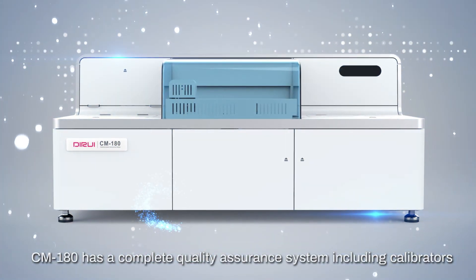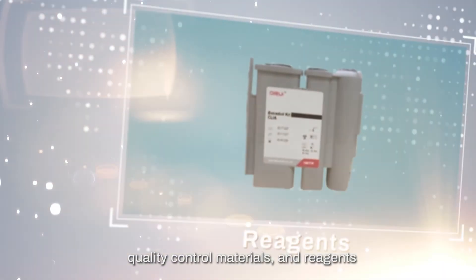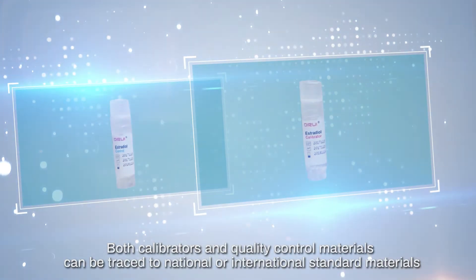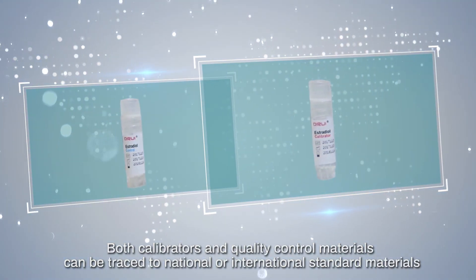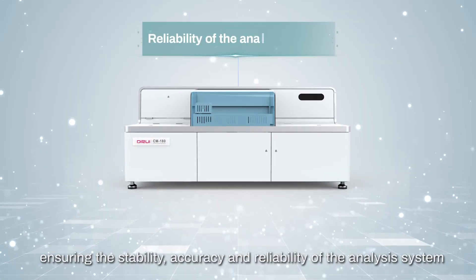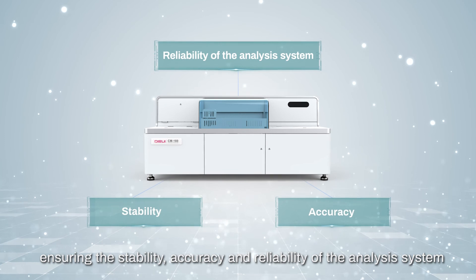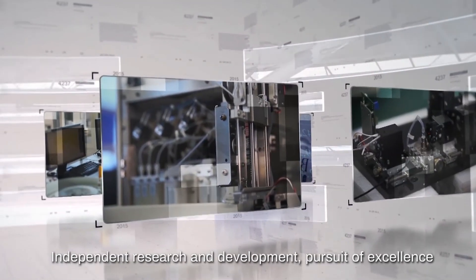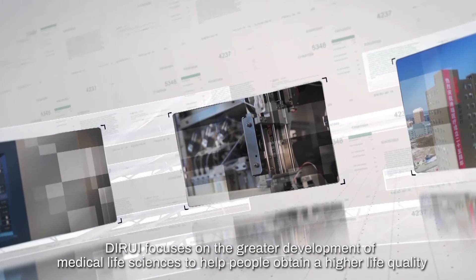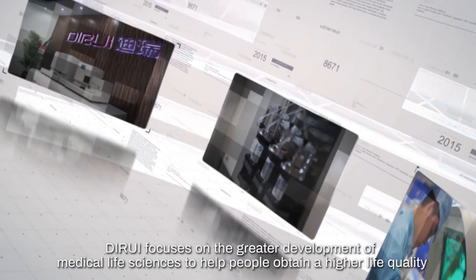CM180 has a complete quality assurance system, including calibrators, quality control materials, and reagents. Both calibrators and quality control materials can be traced to national or international standard materials, ensuring the stability, accuracy, and reliability of the analysis system. Through independent research and development and pursuit of excellence, DIRUI focuses on the greater development of medical life sciences to help people obtain a higher quality of life.